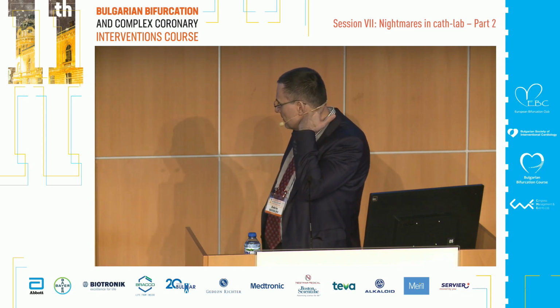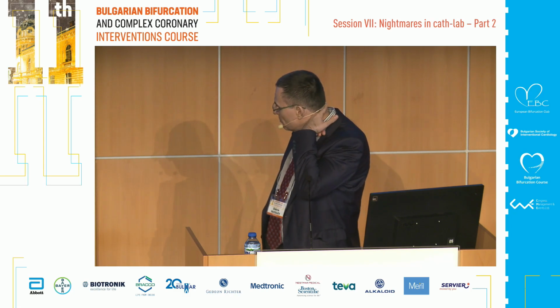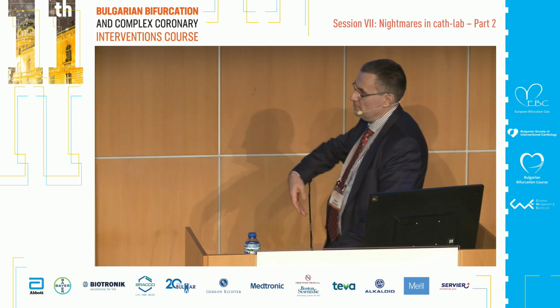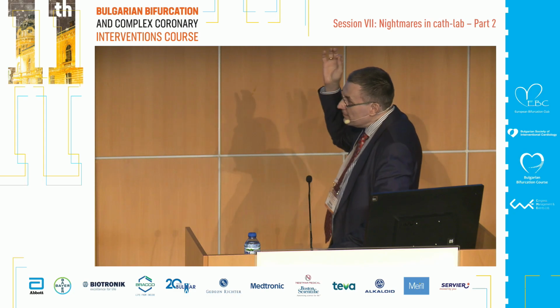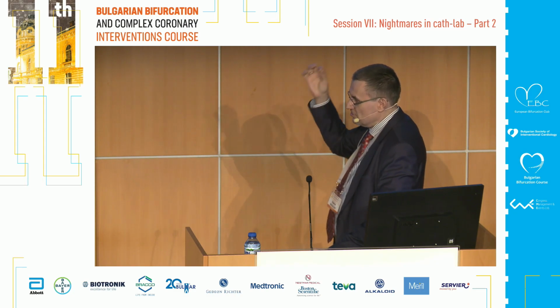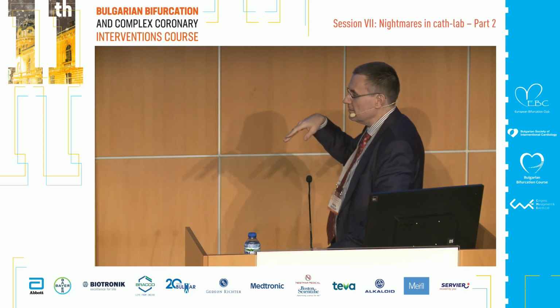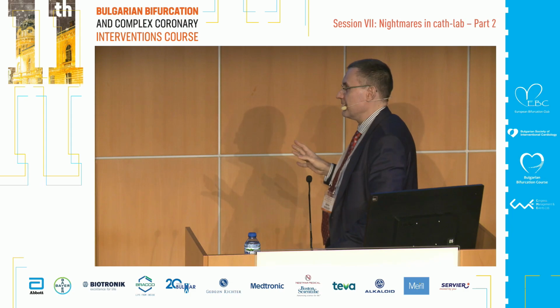And it is surprising for me that when you cross subintimally, dilate the subintimal space, and then try again over the wire into the true lumen, at least in our 3 cases, the balloons passed and were opened.